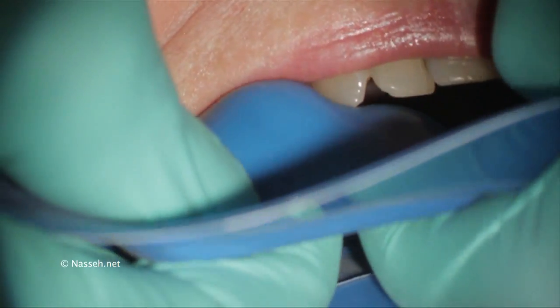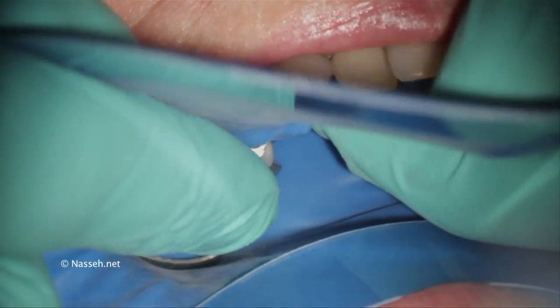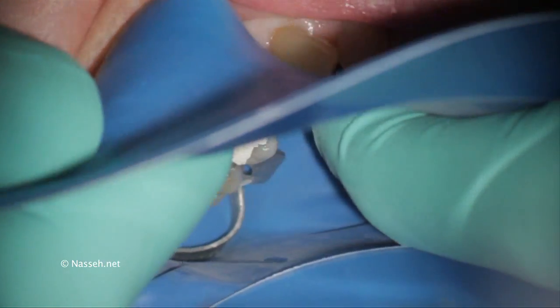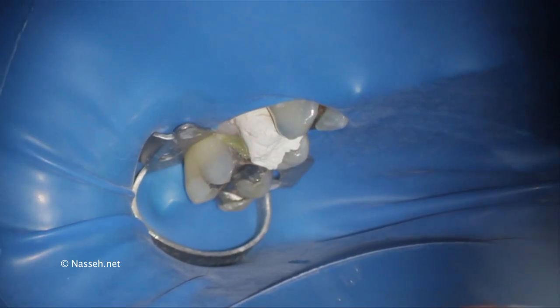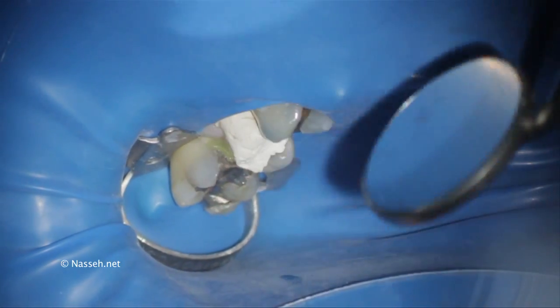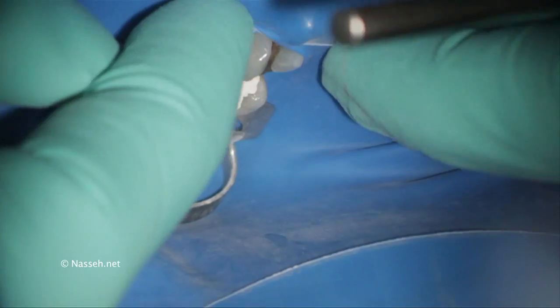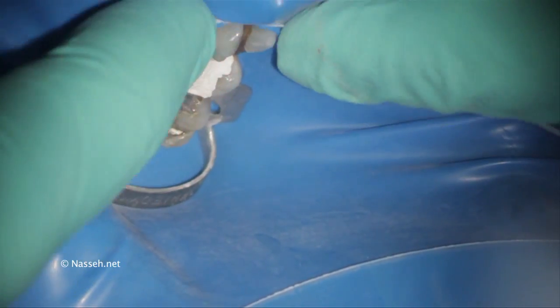After placement of the rubber dam and the clamp in place, the rubber dam is pulled through. Here I'm using the mesial area of tooth number five to secure the rubber dam. Generally running the rubber dam through the contact area might be enough; however, passing your floss through that will secure the rubber dam better.